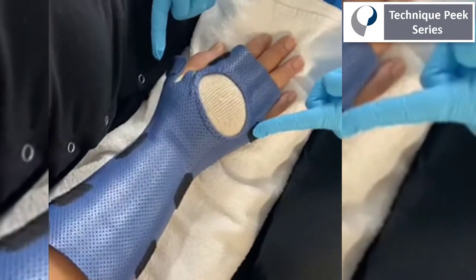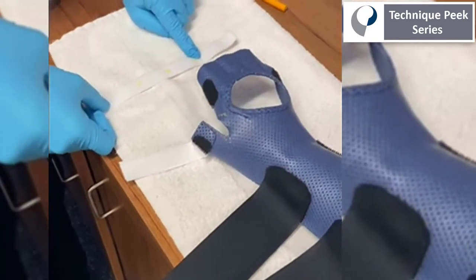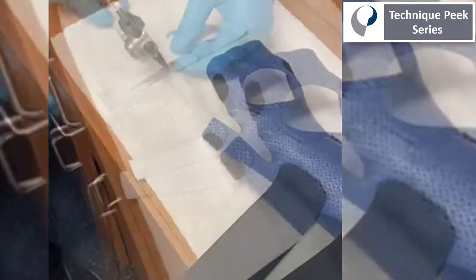Here, I'm demonstrating where the Velcro straps go. Next, we're going to work on that dynamic finger component using pajama elastic strap.